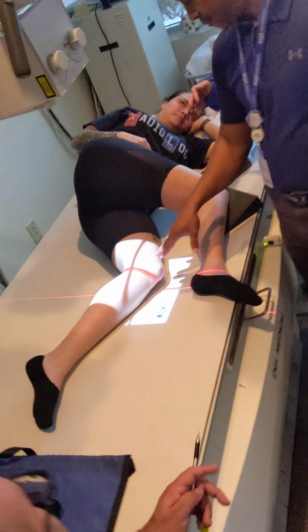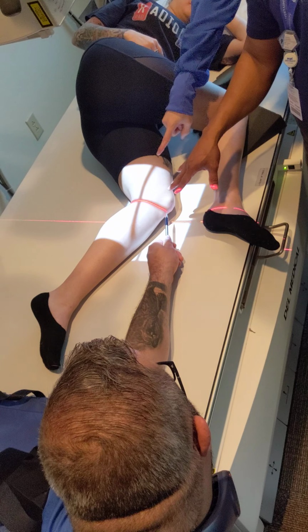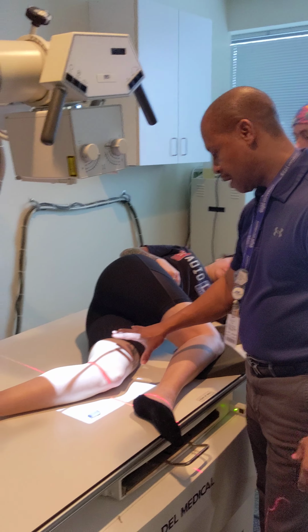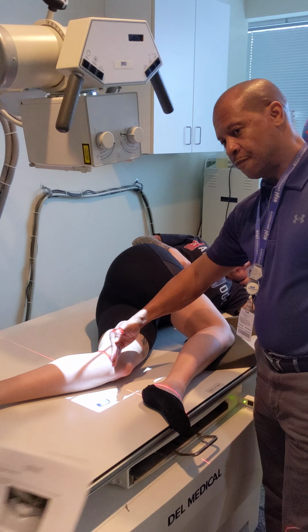And how would you adjust, like, to make it, does that need to be matched with the leg? No, leave the light field the way it is. Don't mess with any of that. Okay. The only thing we're doing is just flexing this.